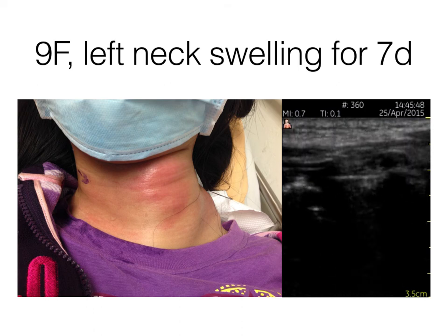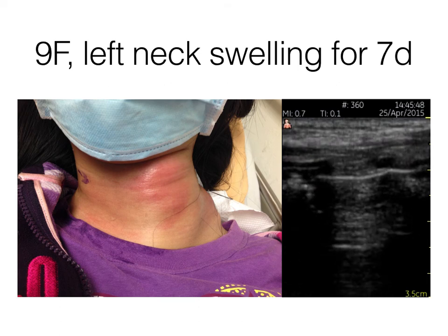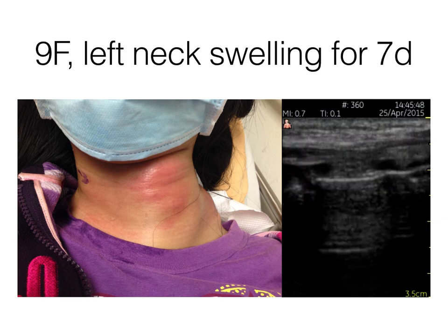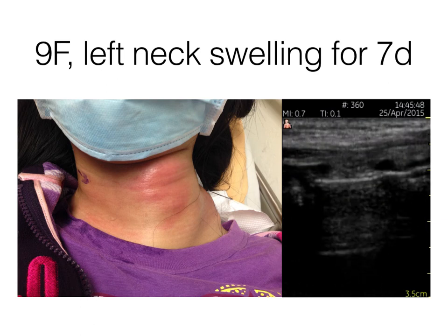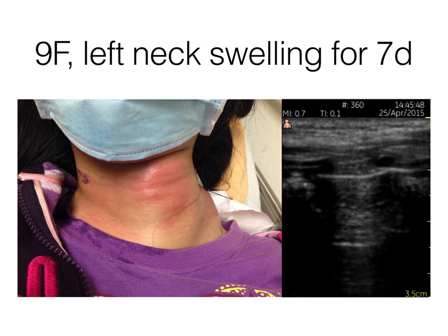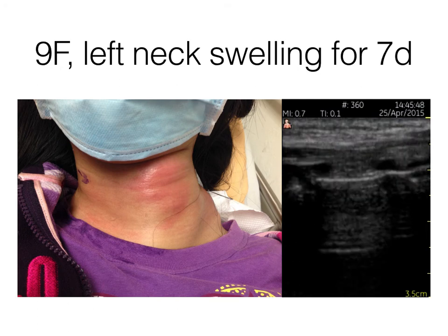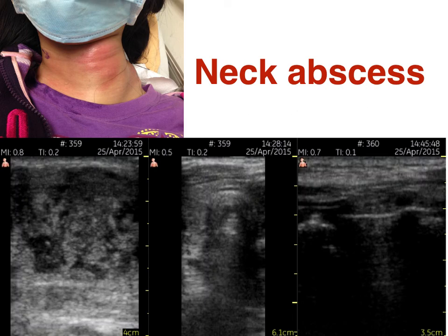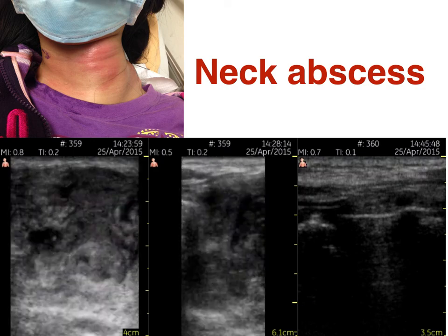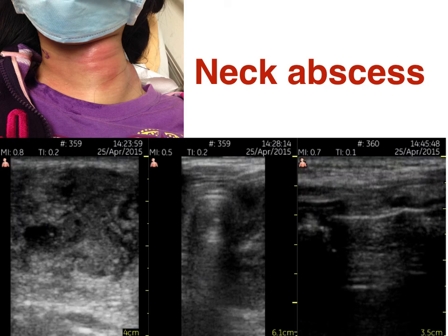What is this structure? Cricoid, thyroid cartilage. And this is the cricothyroid membrane. So I can locate this in case the patient needs surgical airway management. I can find this instead of doing ultrasound again. I can mark here. So ultrasound can help us find the pathology, define the problem, and even make a safer way to do some kind of procedure.